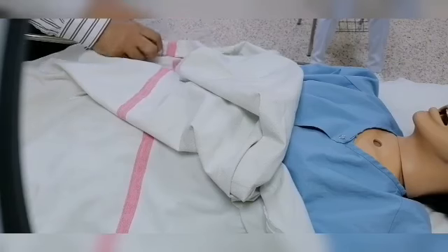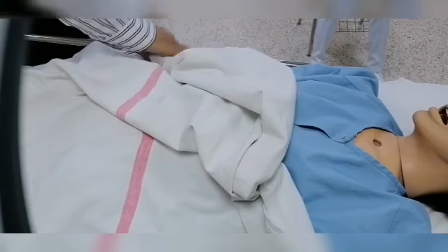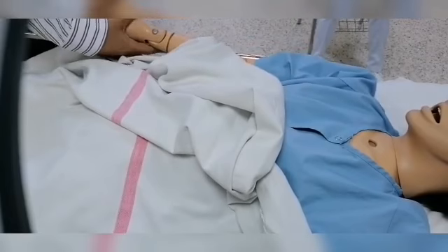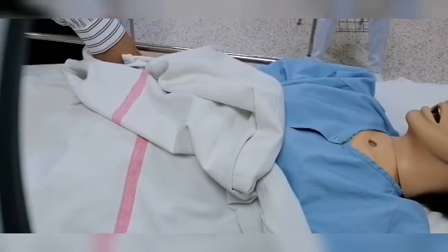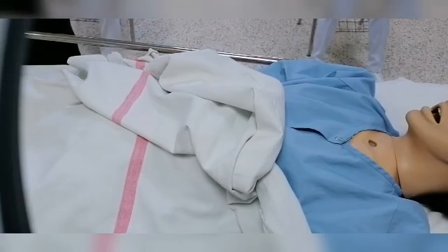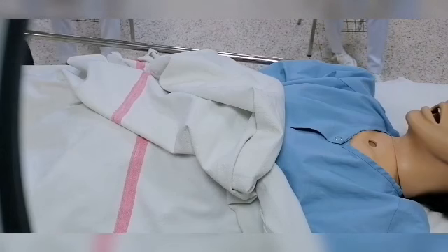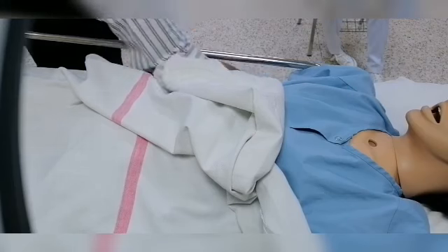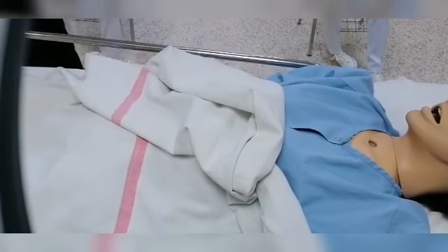Then you have to verify also the client name by asking his name, and also verifying the client name by checking the ID band from his hand. So we have to verify it by two methods. Then we have to put the curtains for the privacy. So those are basic things before doing any procedure. Then after that, we prepare our equipment.